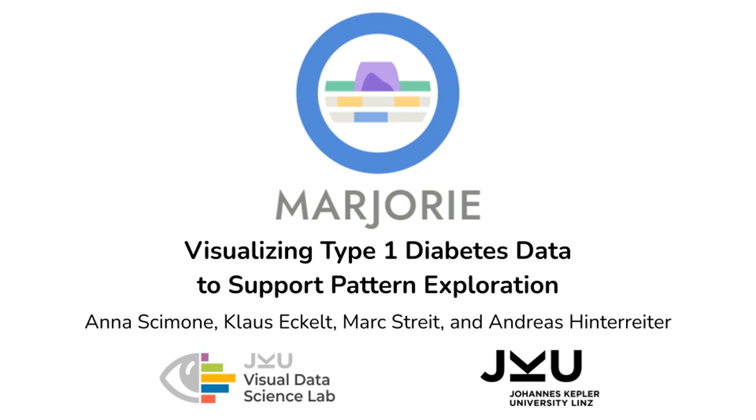In this video, we present Marjorie, our visual analytics approach for the exploration of patterns in type 1 diabetes data.